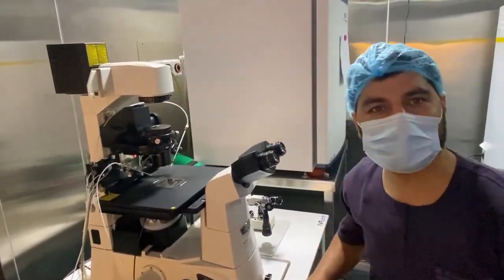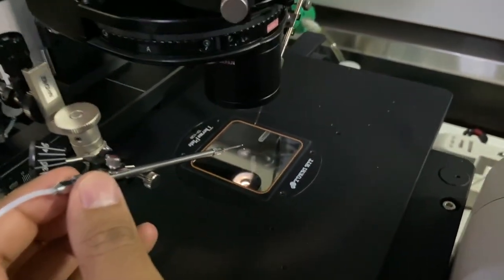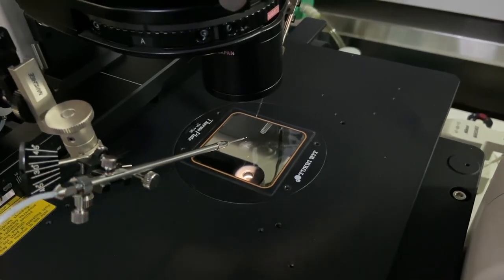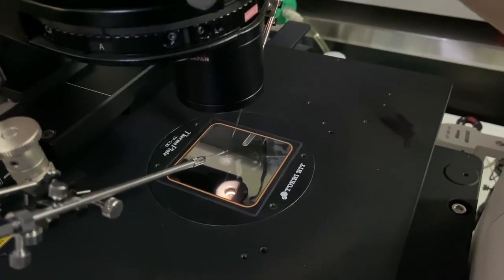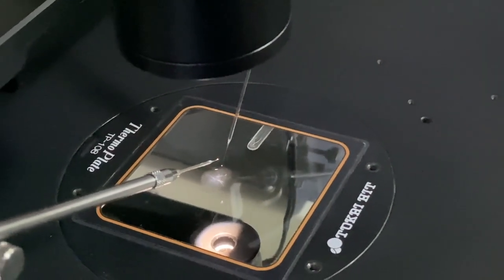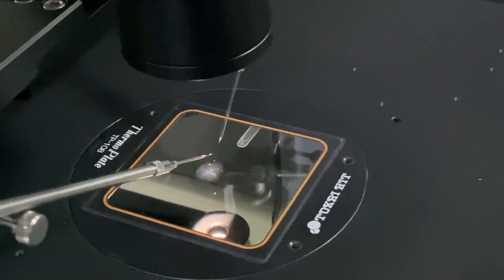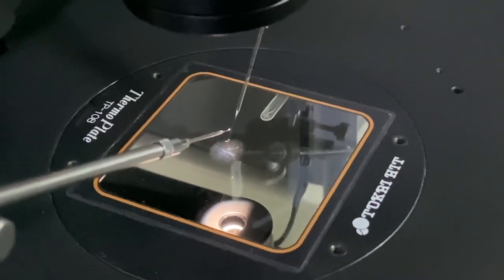So next thing is to bring these needles. This is the holding needle towards the light. You can see the tip is shining. Similarly, I bring this injecting needle close to the light. You can now see the tip is shining. After that, I will bring it a little closer so that I can see it properly.